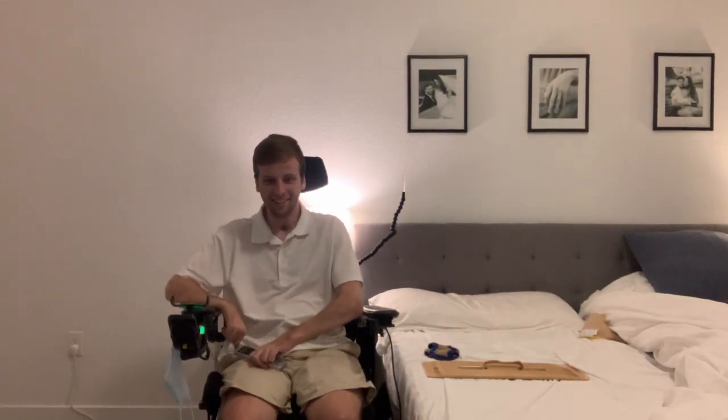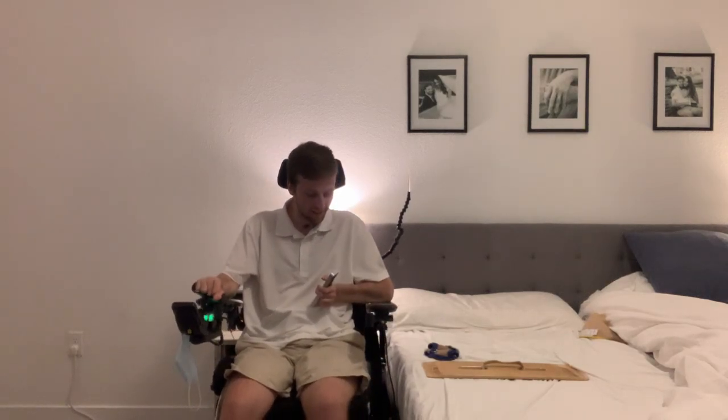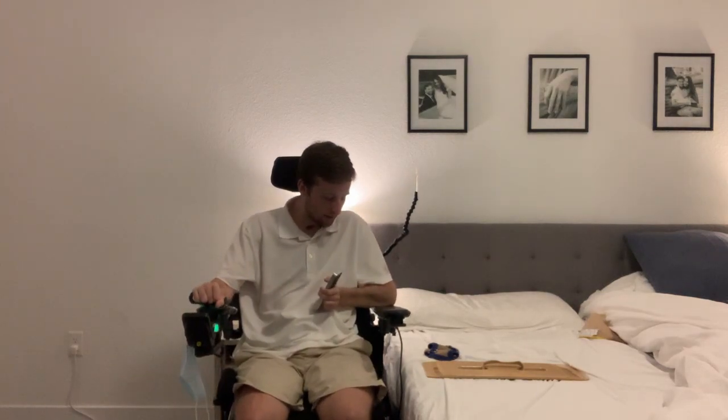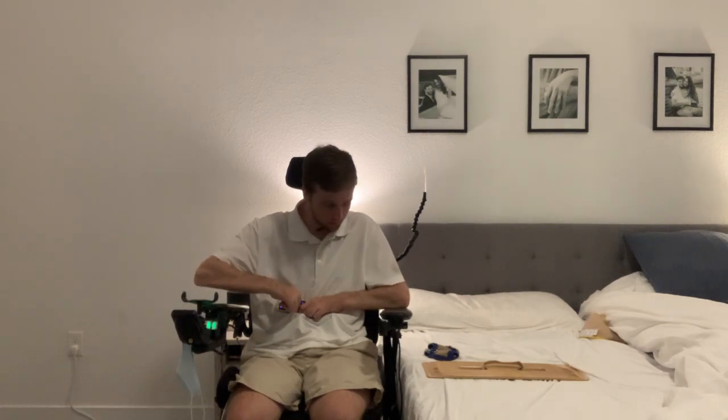And we're back — sorry about that accidental toe crunch, it happens. Alright, next step: I'm going to line up with the bed. It still looks a little bit high, so I'm going to lower it a little bit more with the remote.